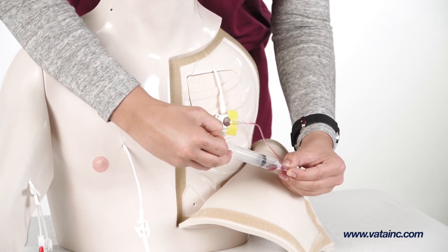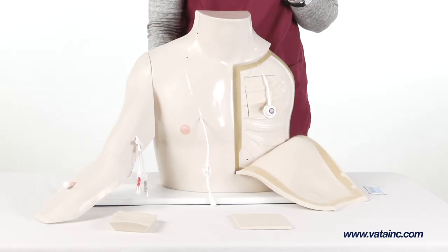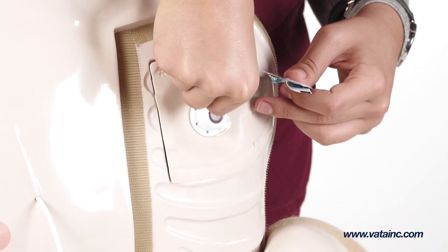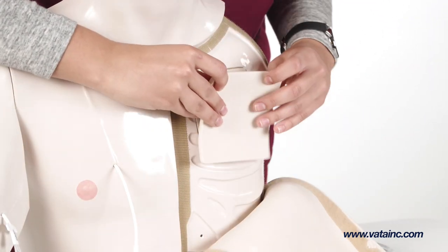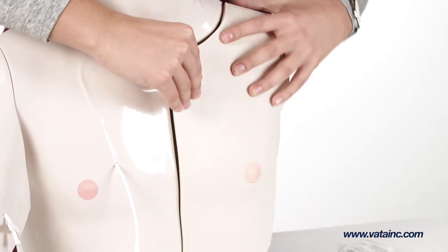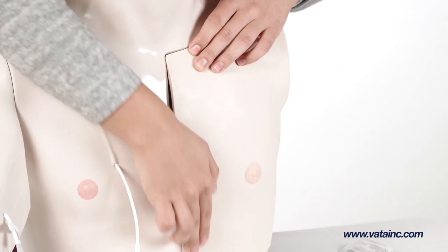The torso is now ready for use. Chester Chest can be used to simulate accessing normal, tipping, wandering, or deeply placed IVAD placements in the left chest area. Fluid can be infused and blood withdrawn from all lines.